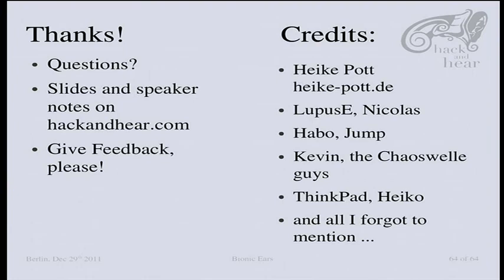Actually, there are hearing aids that claim to counter the tinnitus, that they regenerate the counter frequencies against it. I also asked my acousticians or audiologists about that. They usually are not really offered, and even if you ask for it, they tell you usually they don't really make a difference. My choice was just to take a normal hearing aid, and because the frequencies that you don't hear very well are amplified, the tinnitus in relation gets less loud, and you learn to ignore it. That's not really magic, but that's the only thing that seems to work.